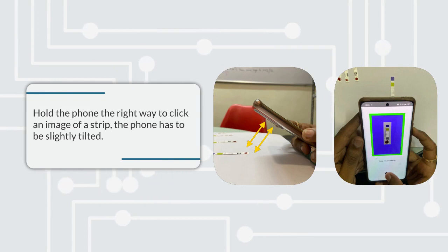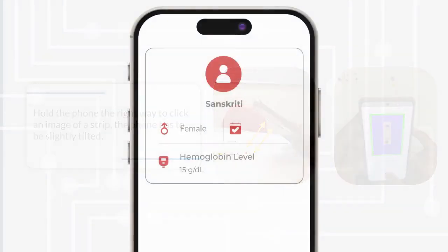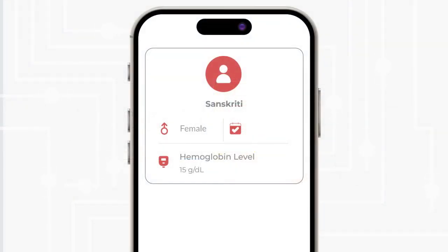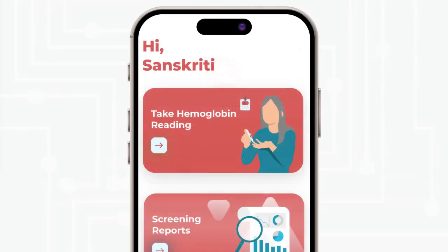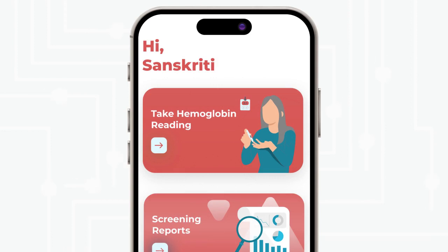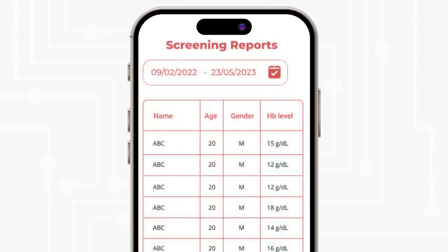Hold the phone the right way to click an image of the strip — the phone has to be slightly tilted. You will see the hemoglobin result. Click on the screening report to see all past screening results. You can select the date filter for a specific date range and download the reports.